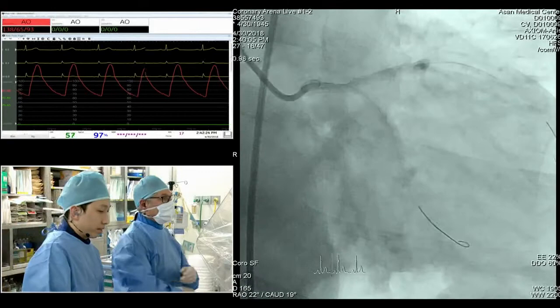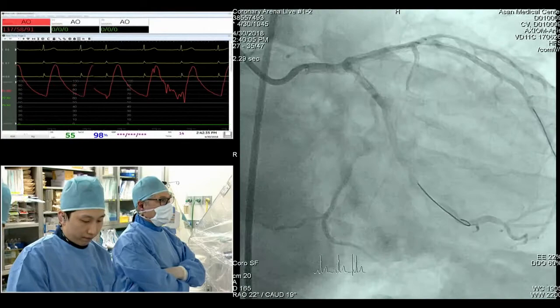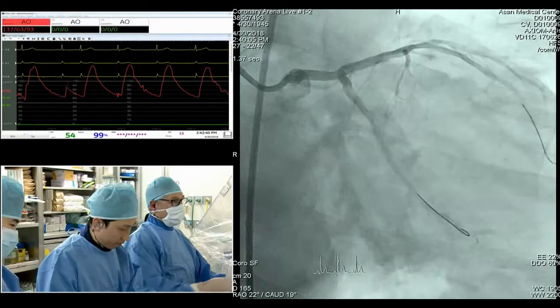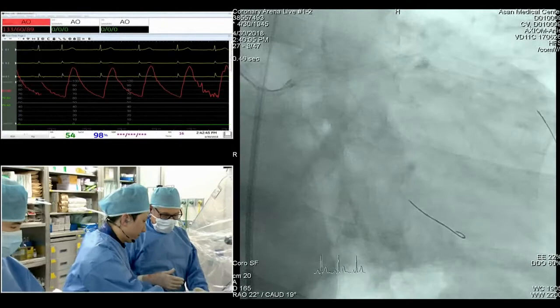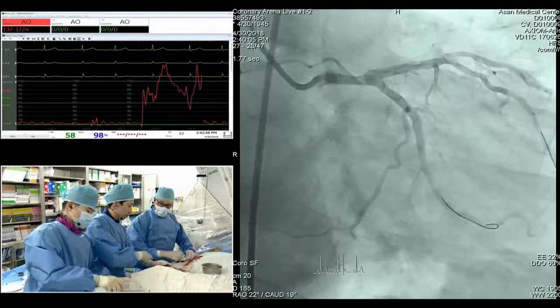For me, it's very important to open the strut of this stent toward the circ because it's a very big circ, 3.5. But some people are not doing this. And today we have no randomized study showing one technique is better than the other one. So this is a 4.5 by 10 balloon. Semi-compliant? Yeah, okay.